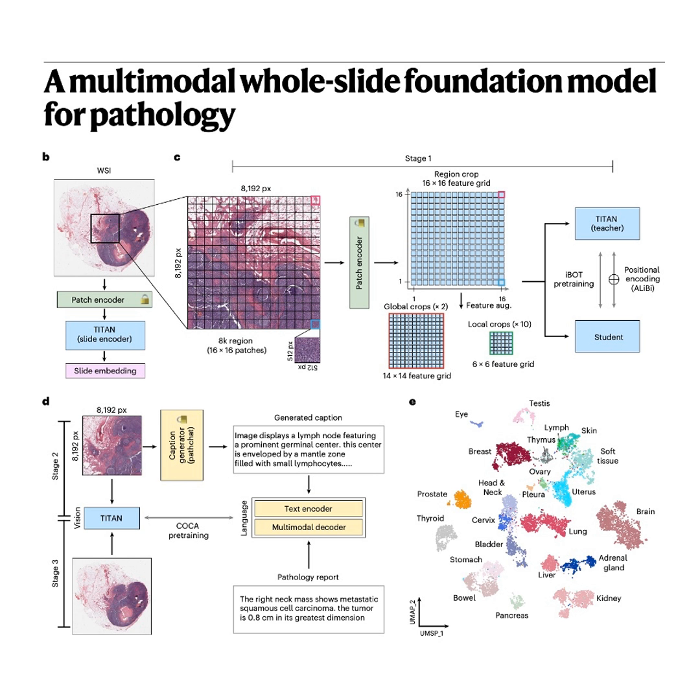On the 30-class eBrains subtyping task, Titan doubled the balanced accuracy of the previous leading model, Prism. It showed a plus 121.9% balanced accuracy gap. Doubling the performance of a leading model in zero shot. That is the definitive confirmation that the vision language alignment worked. It demonstrates true, deep generalization. The model isn't just memorizing, it's reasoning. So it's got a truly portable understanding of pathology.